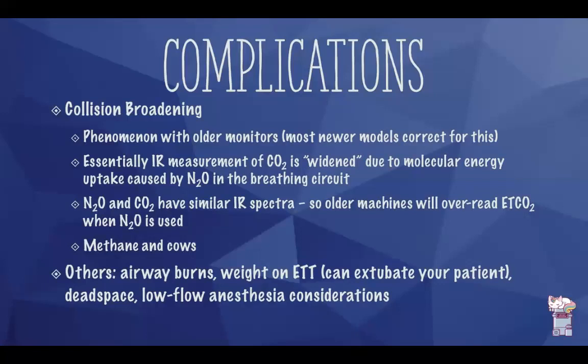Complications can arise with any monitoring system, and this one is no exception. One of the major complications with monitoring end-tidal CO2 is a phenomenon called collision broadening. This happens typically with older monitors, as newer monitors have already been adjusted to correct for this phenomenon. Infrared measurement of carbon dioxide is widened due to the molecular energy uptake caused by nitrous oxide in the breathing circuit.